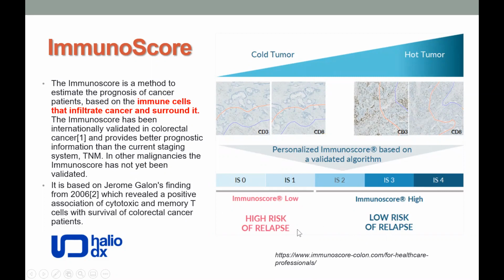And now you can start to see if they correlate. In their research, they do show this immunoscore is already related to the prognosis. So even with a very simple regional cell count, you already achieve much better than not containing any spatial information.